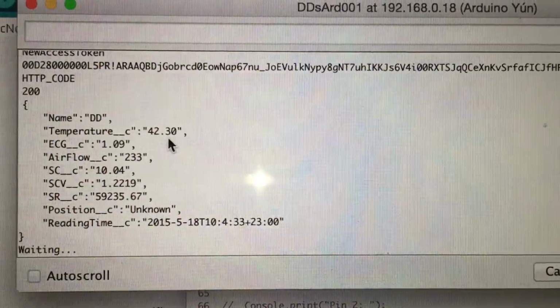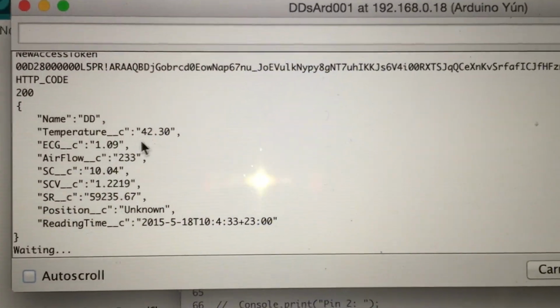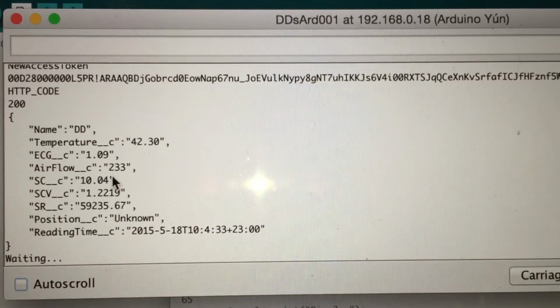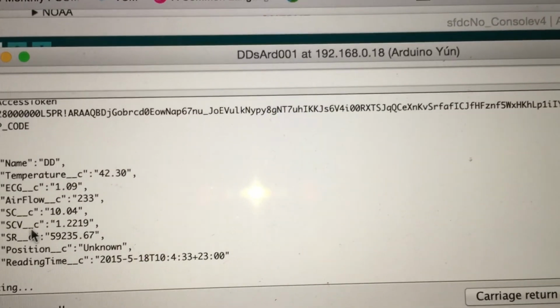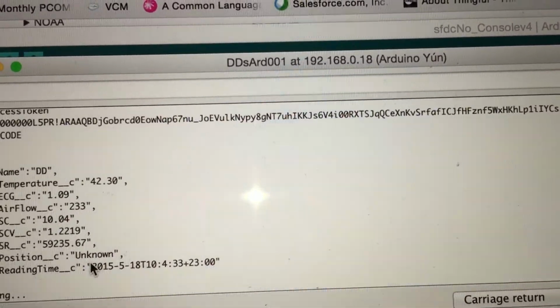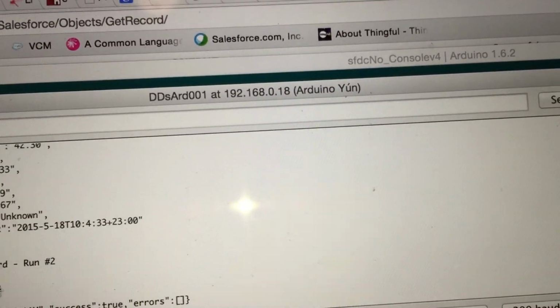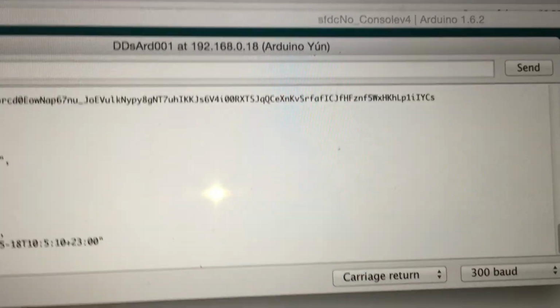The temperature currently, that's because it's just next to the light, 42 degrees. ECG, it's reading. The airflow, I've not yet connected, so it must be a lot of air around. The skin conductance, the skin voltage, the skin resistance. The position at this stage unknown because I'm not wearing it. And of course, the day, date and time. If we keep going, it will of course be writing records onto the Salesforce platform.